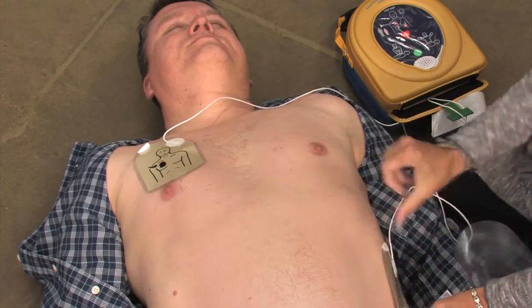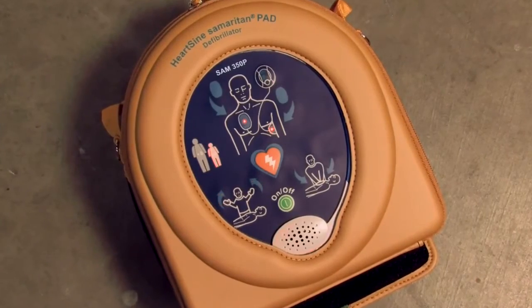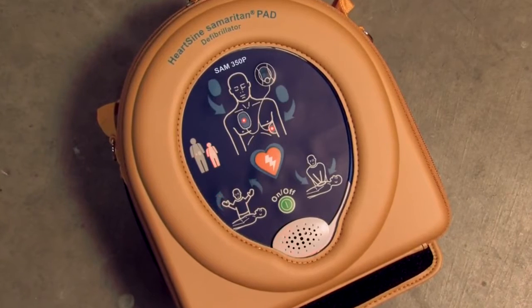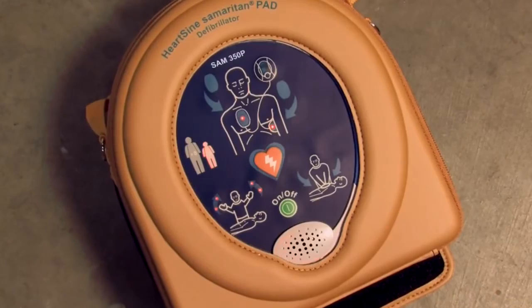Press pads firmly to the patient's bare skin. The Samaritan PAD automatically assesses the patient's heart rhythm. Assessing heart rhythm. Do not touch the patient. Stand clear of the patient. The device recommends whether or not a shock should be delivered. Shock advised.